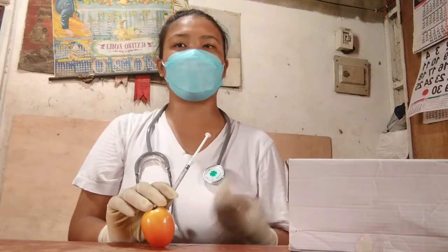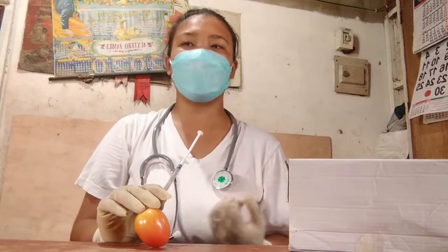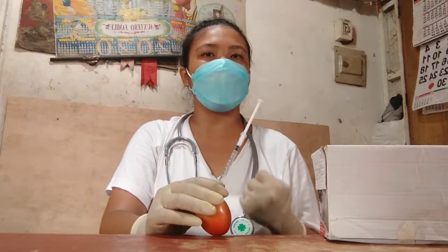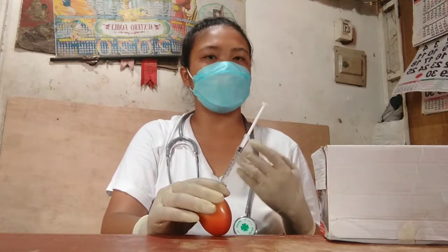A possible adverse reaction may occur if the drug is not intended for intravenous use. Slowly inject the medication. Rapid injection may be painful to the client. Injecting slowly promotes comfort, allowing time for the medication to disperse in the tissues.